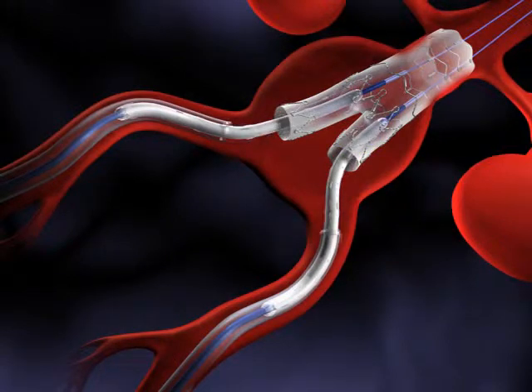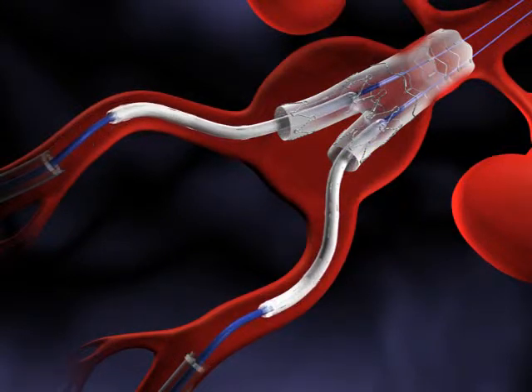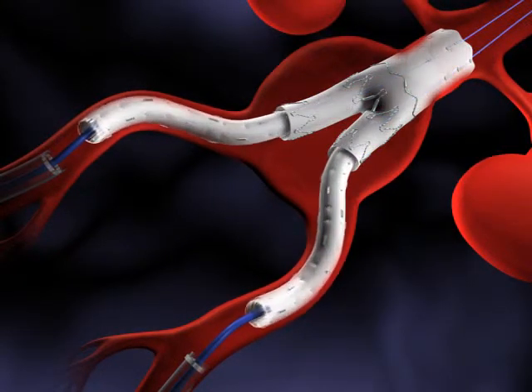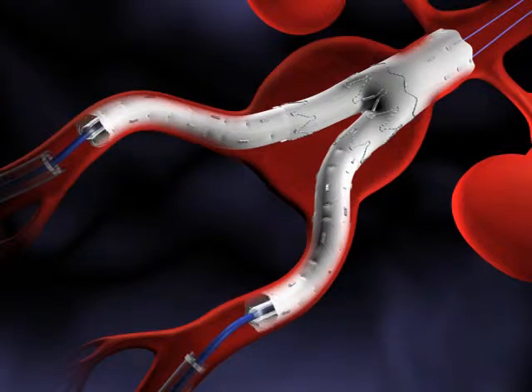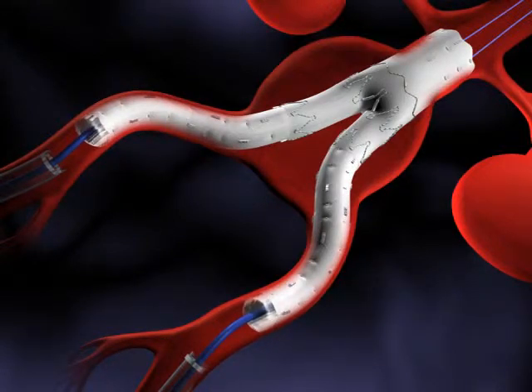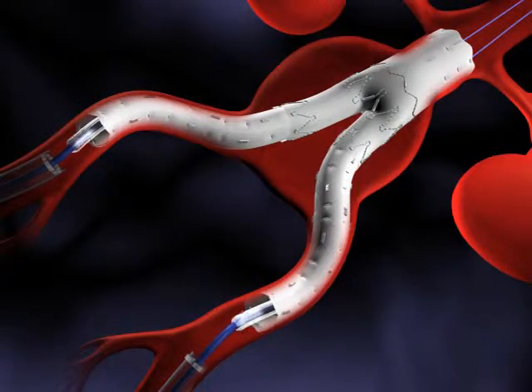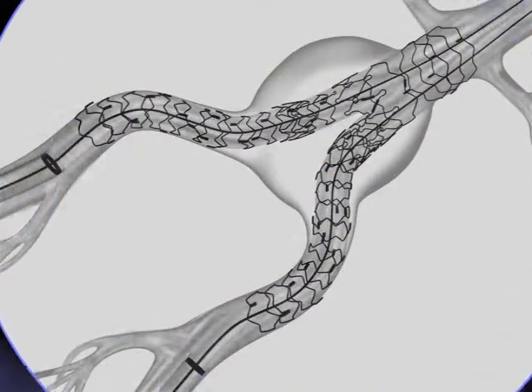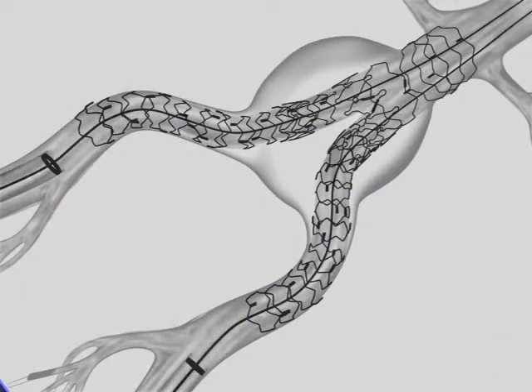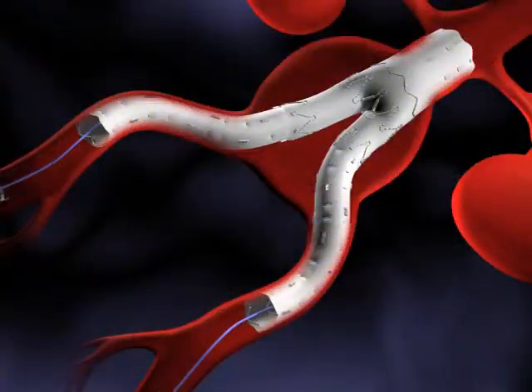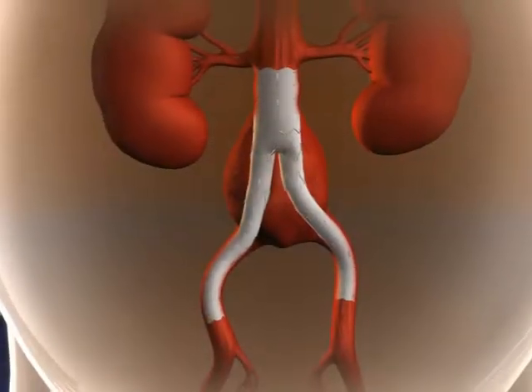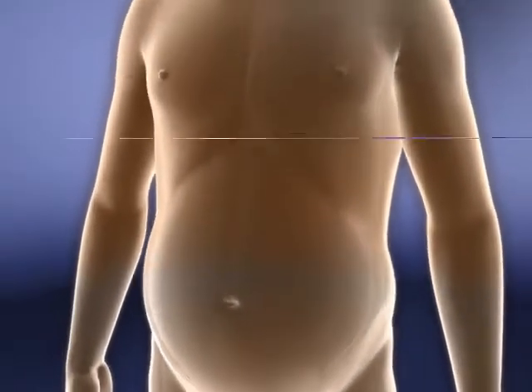The iliac grafts are advanced simultaneously until the radiopaque markers of the catheters align with the radiopaque markers of the sheaths. Pulling the sheaths back exposes the iliac grafts. The balloon catheters are inflated twice to five atmospheres for 30 seconds. After final deflation, the balloons are stretched to reduce their profiles and removed. A completion angiogram follows, then removal of the guide wires and introducer sheaths, and closing of the access sites completes the procedure.